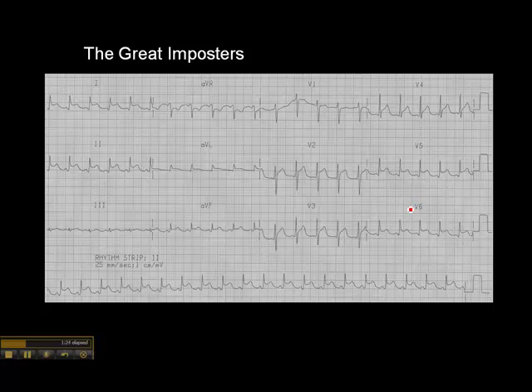This particular case was a 19-year-old who had a fever and a cough for about three weeks, and a bit of pneumonia. Where we see ST elevation diffusely across all the ECG leads, this is classical of pericarditis. So this patient had a pericarditis.